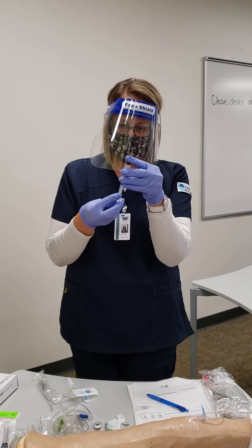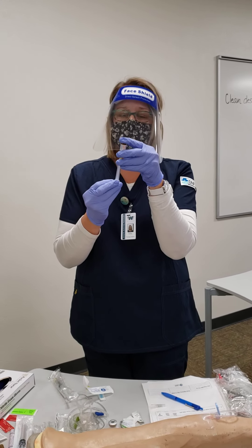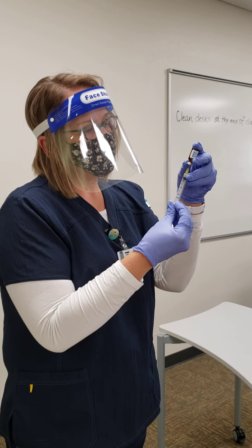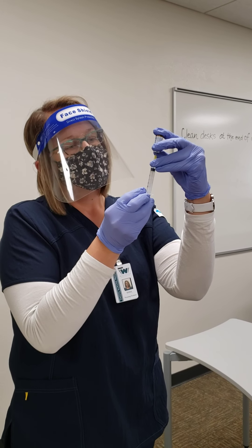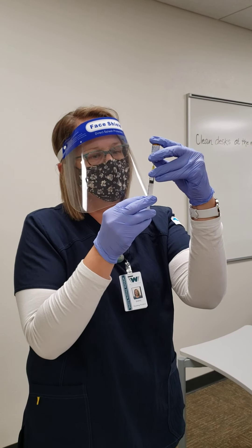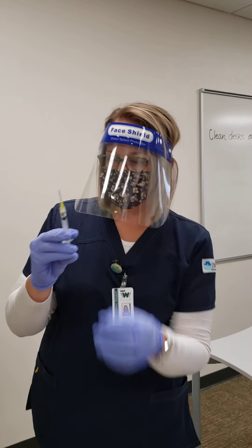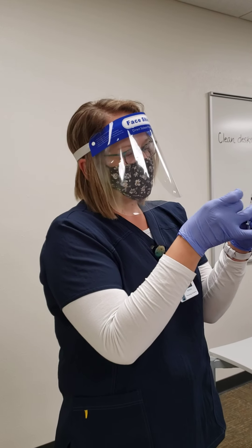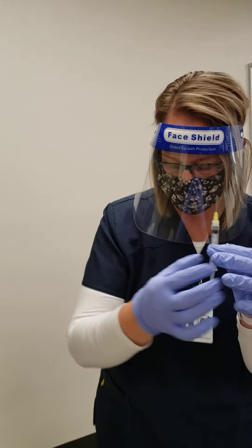I invert the bottle and pull up the medication. I bring it back down and make sure my bevel is underneath where the med is. I double check that I have 0.4 milliliters of morphine and get my bubbles out. Then I double check with my second nurse that I have 0.4 milliliters.